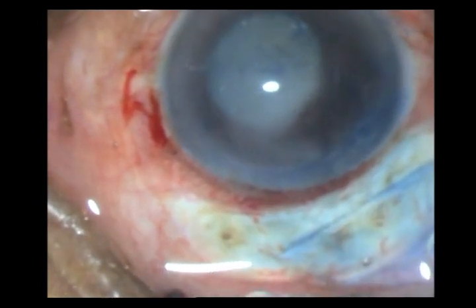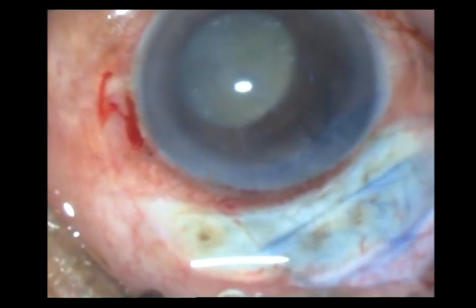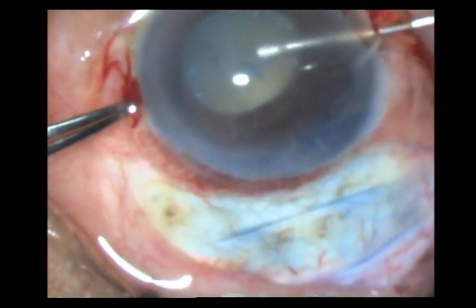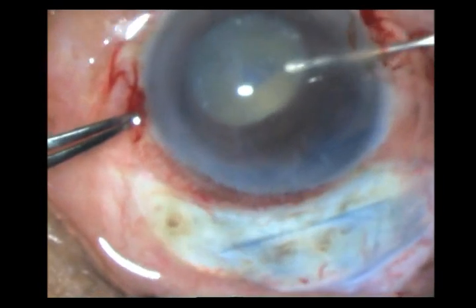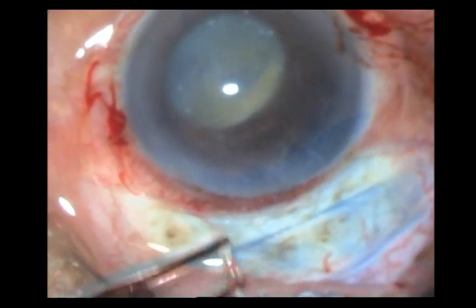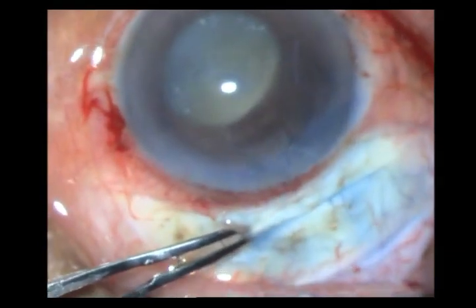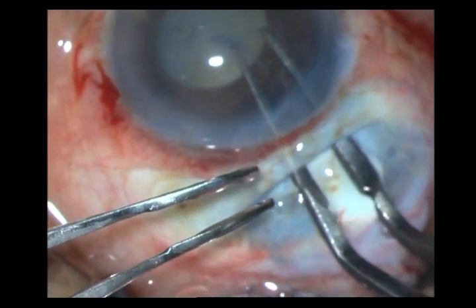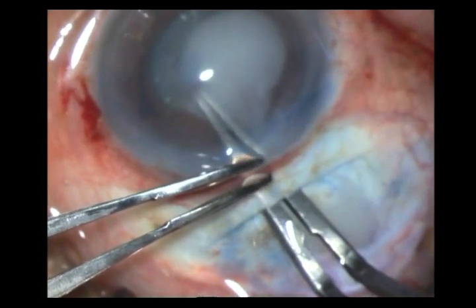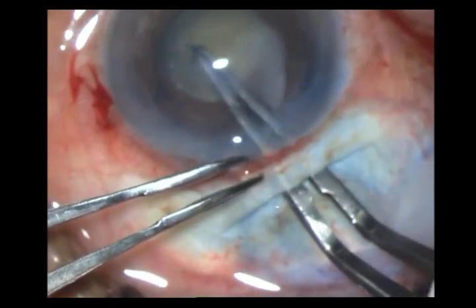You will see me putting in HPMC very often. I once again continue my rhexis with the cystotome. It is not very easy — the nucleus itself is very mobile, and hence I just increased the incision a wee bit and, taking a Utrata forceps, I am very carefully watching the peripheral tag and fashioning my rhexis. And there you have it — the rhexis is done.